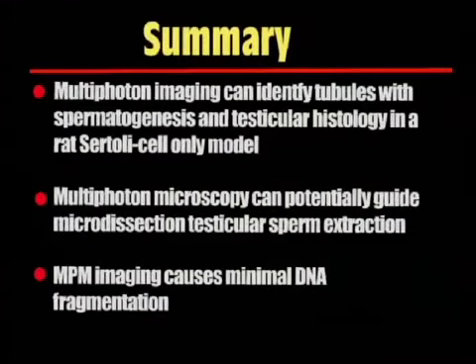So, in summary, these results indicate that multiphoton imaging can be used in a rodent model to identify focal sites of spermatogenesis. MPM imaging could potentially be used to guide testicular sperm extraction in patients. Multiphoton imaging is safe based on TUNEL testing. Functional sperm evaluations are underway to confirm the safety of this intraoperative imaging technique.